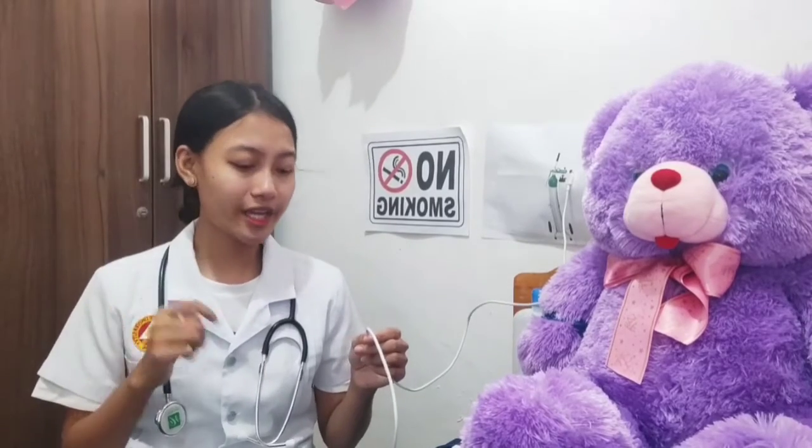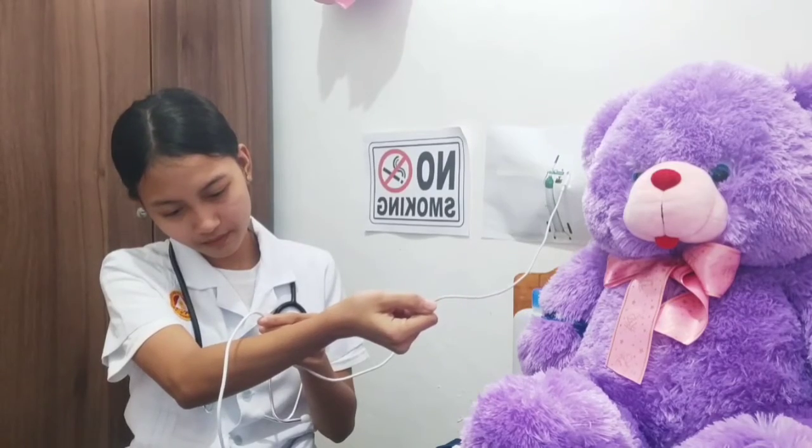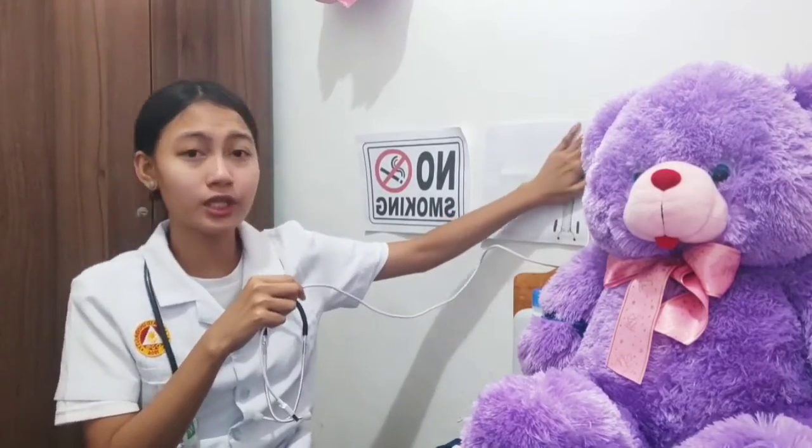After that, we check that the oxygen is flowing freely through the tubing, there are no kinks in the tubing, and the connections are airtight. There should be bubbles in the humidifier bottle.